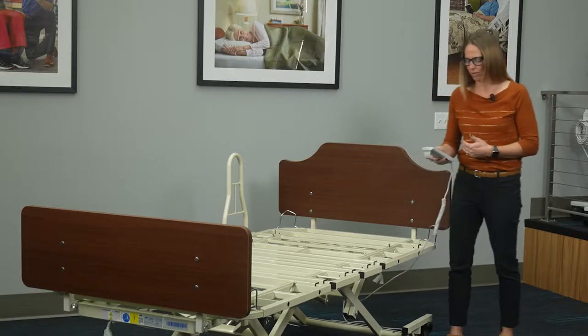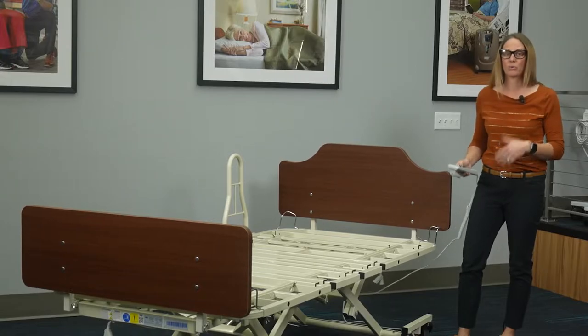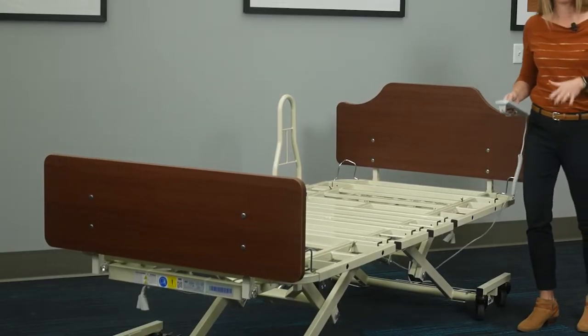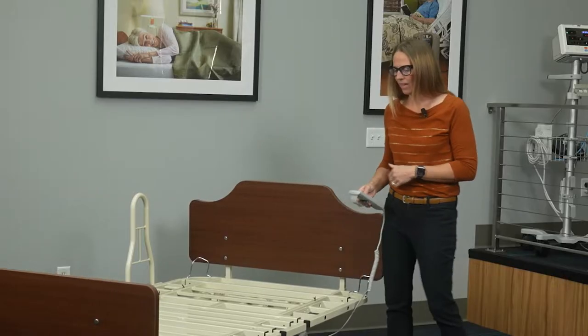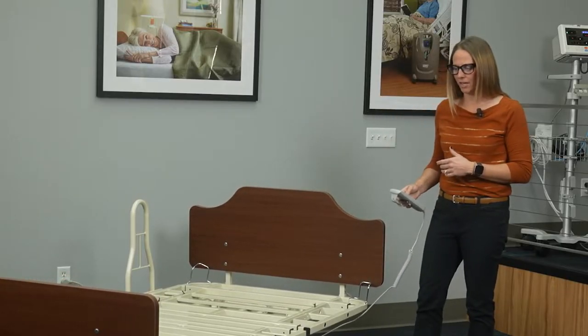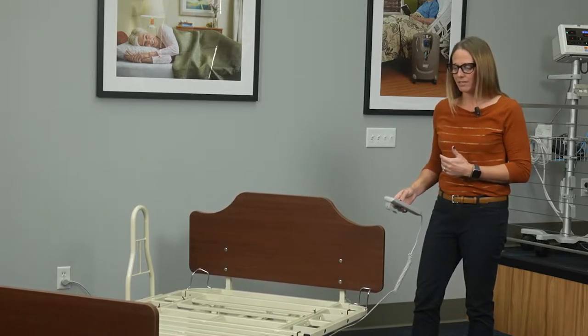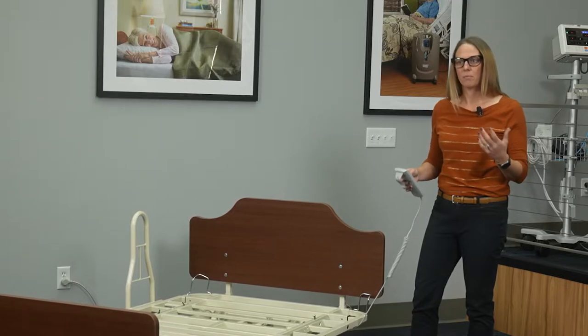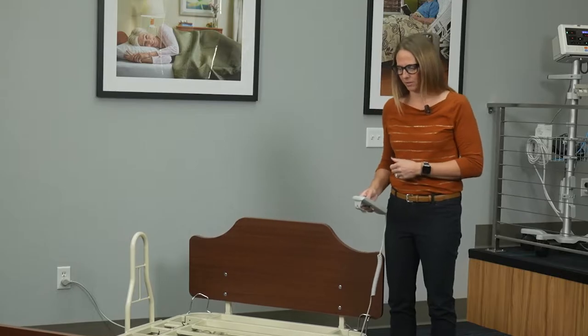Usually you'll see low heights around 10, 11, 12, even 13 inches, but this one goes down to 9 inches, helping keep your residents really safe in case they do roll out of bed. It also has a travel height of up to 30 inches, which is great to help staff when they're turning and repositioning residents in bed without hurting their back during that process.